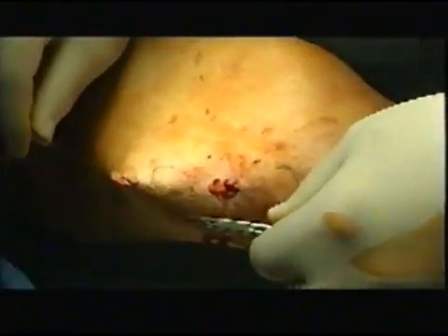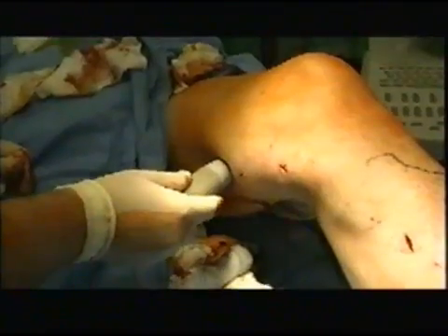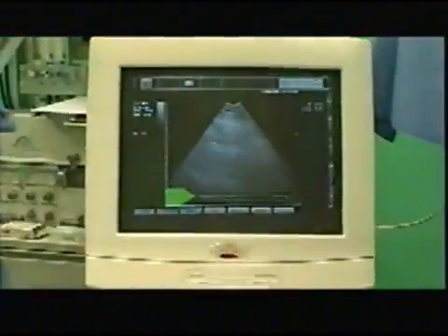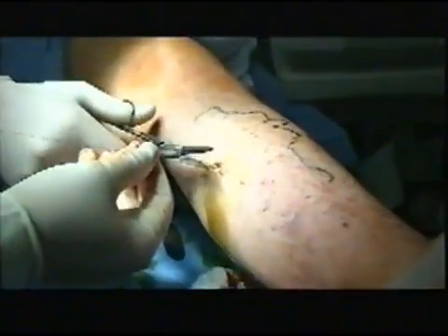Here you see the red spotlights of intravenous laser light transilluminating the skin. This is the post-op doppler evaluation of venous parietal wall damage.